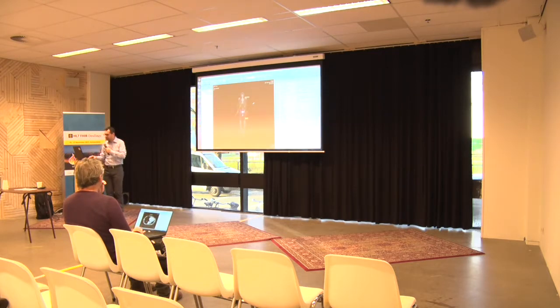So window level is essentially DICOM talk for brightness and contrast. It's not exactly the same, but it's close enough. So if this is me trying to do window level, when I press and hold, moving left and right will adjust one of the two, brightness or contrast, and then up and down changes the other. So go up here. I guess this is not really a good image.